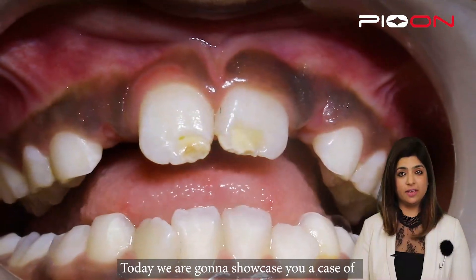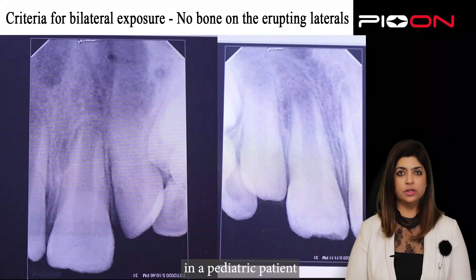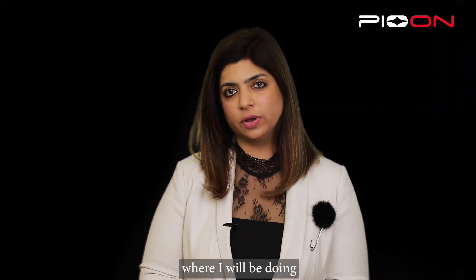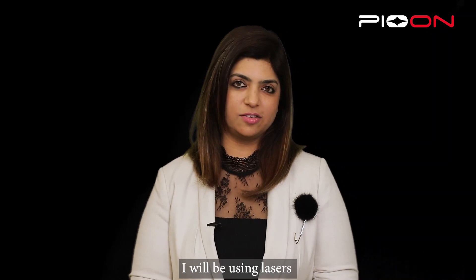Namaste everyone, this is Dr. Sana Farashta here, periodontist and a laser specialist. Today we are going to showcase a case of orthodontic exposure of a tooth in a pediatric patient, and a comparison video where I'll be doing the scalpel technique on the right side to expose it, and on the left side I'll be using lasers to expose it.